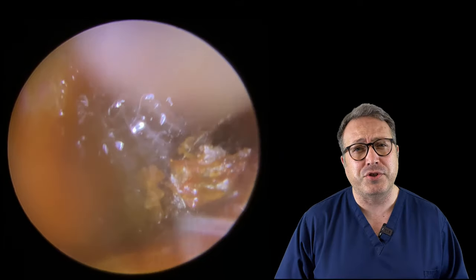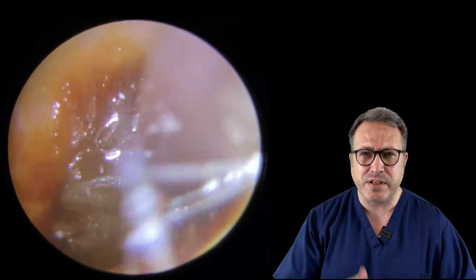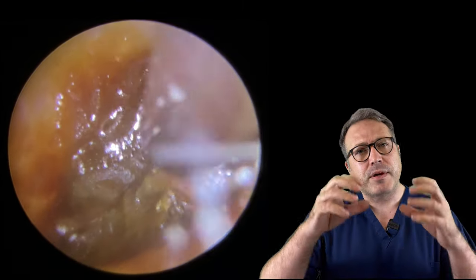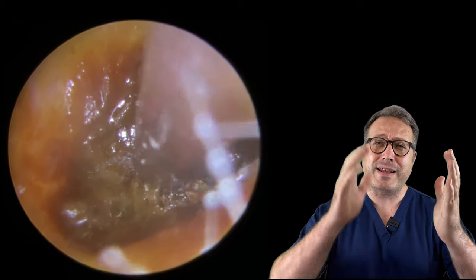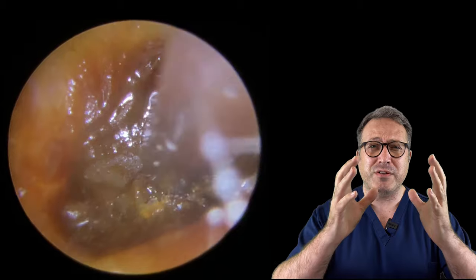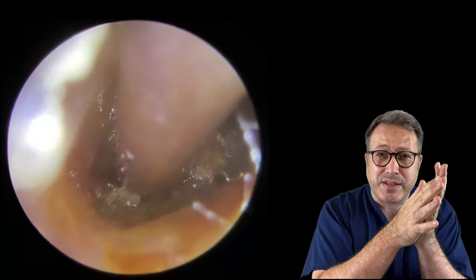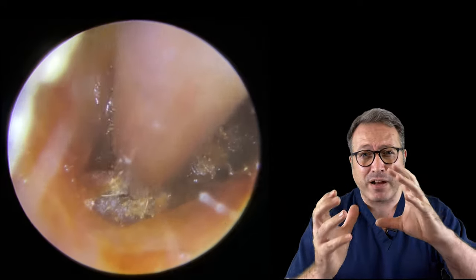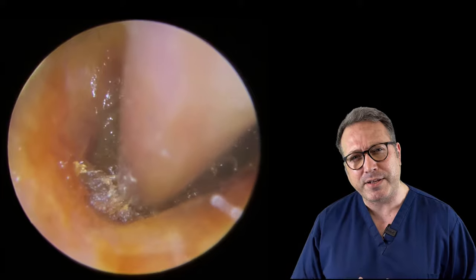What I'm doing here is just taking a little bit of olive oil, just introducing a little bit into the canal. We've got to try and soften this up as much as we possibly can, because if it stays hard like this - don't forget it's going to be dried at the back end and the front end - it's going to become a solid block. There's no wiggle room in here because we're right against the eardrum, so we can't maneuver it back and forth as we normally would. We've got to rely solely on the suction bringing this down the canal.